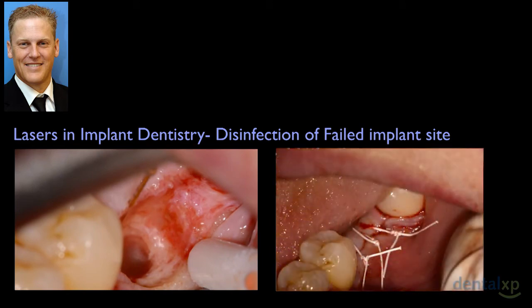I present this to you just so you have some idea where the lasers could be used for peri-implantitis when we talk about it in the last portion of my lecture.